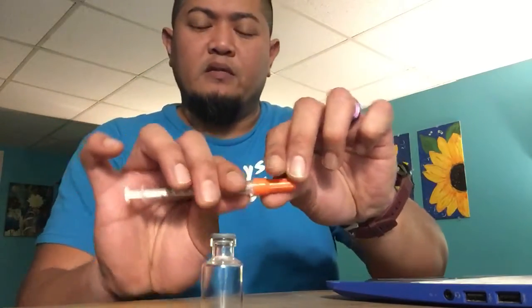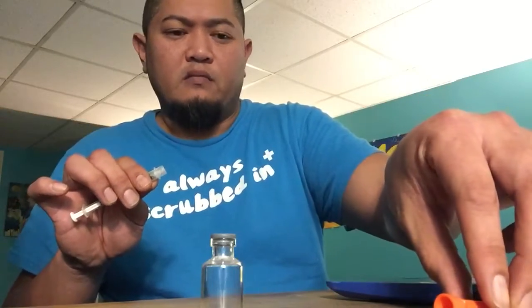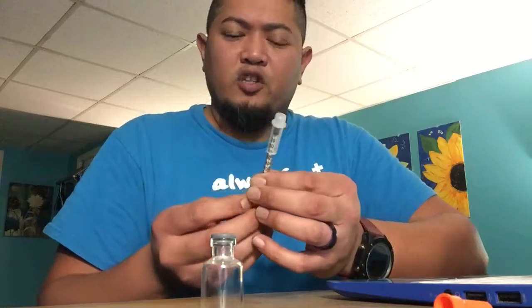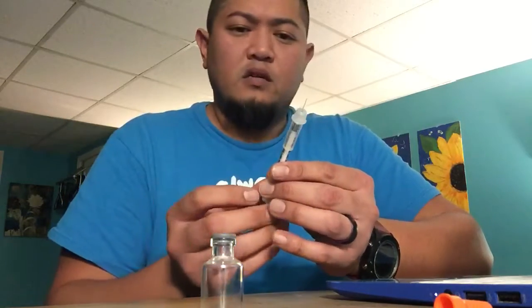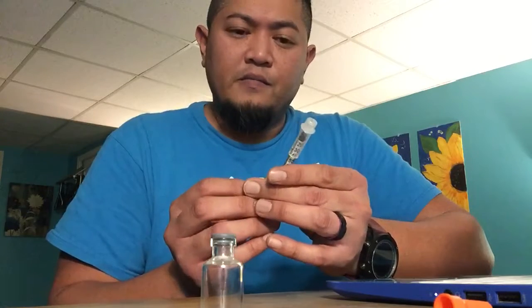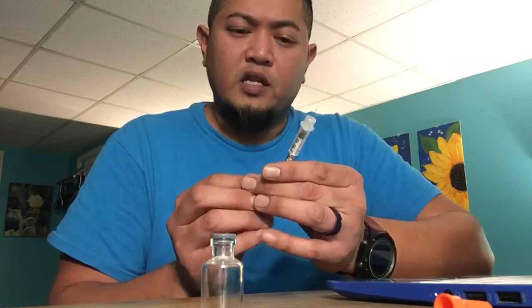So you uncap it, place the cap on a clean, flat surface, and you're going to draw. It says there are 4 units of medication, so you're going to draw 4 units of air. The line right before 5 units, right there.